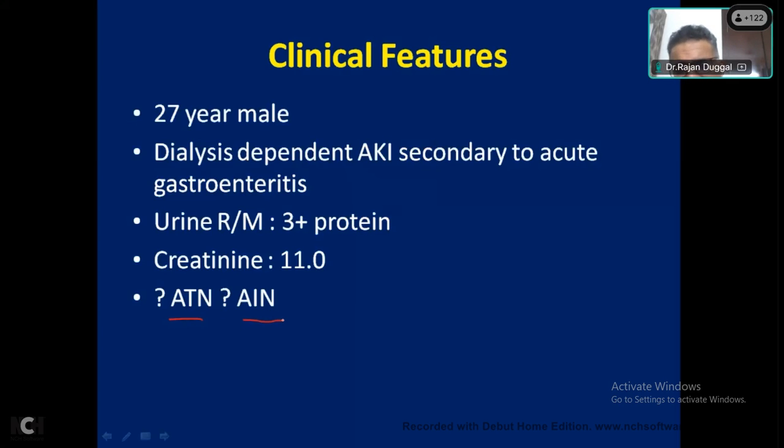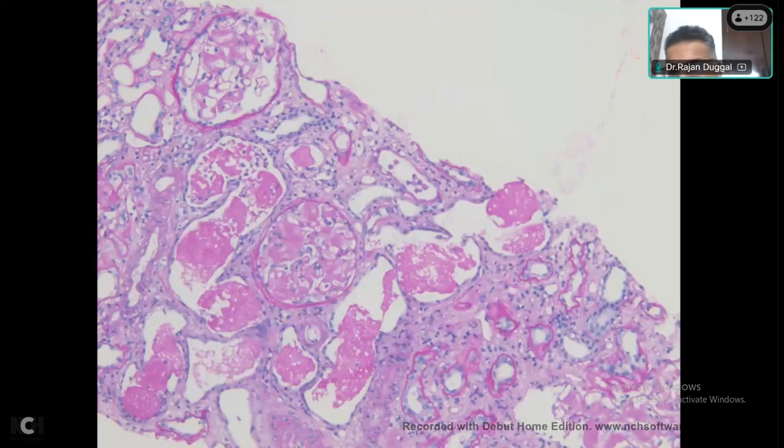So we'll straight away go to the case. Yes, Dr., please describe. First tell me, is this an H&E stain or a PAS stain? This is a PAS stain because the basement membranes are highlighted. Very good. We can see two glomeruli in this section, and both are showing mesangial expansion by an extracellular amorphous material. It looks weakly PAS positive, and apart from that, we are also able to see extensive tubular damage. There is dilatation of tubules and simplification of the epithelium.